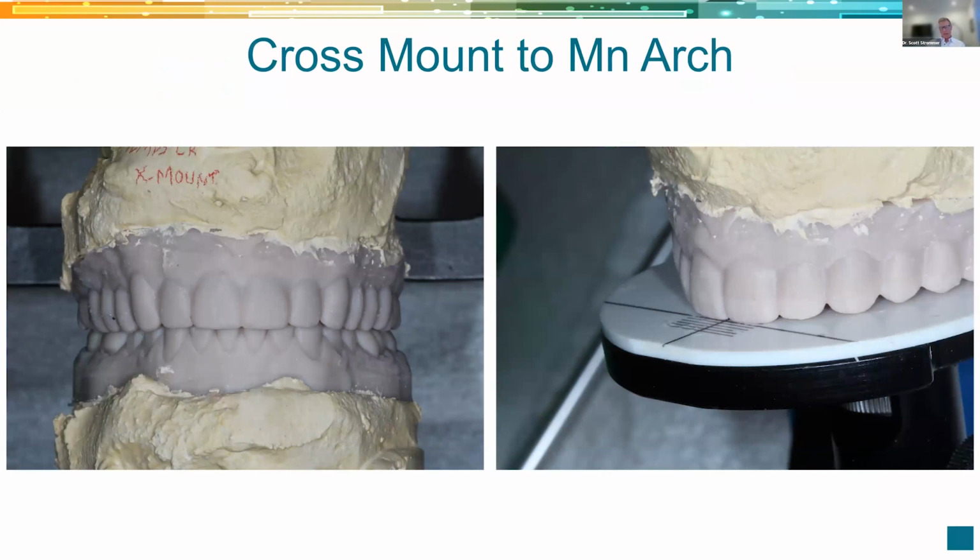I don't quite have, maybe it's my confidence, maybe it's not there for me, but the virtual articulators and the one built into the in-lab software is great. It's good, but I don't have a way of proving it because everything can be manipulated in the software. I really need those provisionals that I had for Eric to be proven, and we call it putting it down on the platform, as you can see here. So everything's tracking.